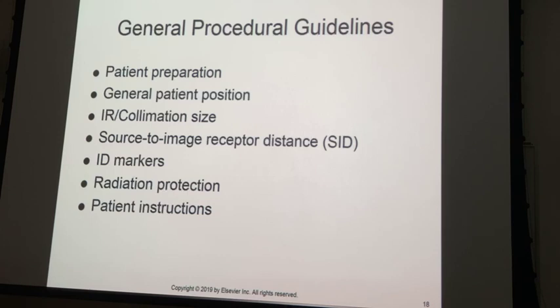So the rib itself, it's really no big deal that the patient has a broken rib. It's just what is the broken rib going to lead to? So we talked last week in the test review about the first images that you shoot on a trauma series, and the reason we shoot chest X-ray is primarily for this. The chest X-ray also satisfies the requirement of the ribs. It's not ideal because the grayscale is going to be much longer than what we would like to see on ribs, but again, the danger is not whether or not the patient has a broken rib, but rather what's going on with the broken rib.